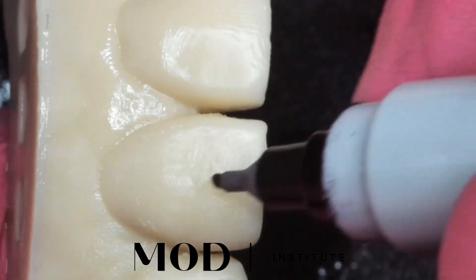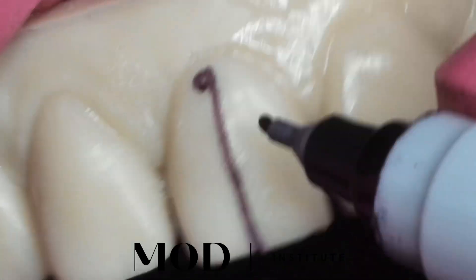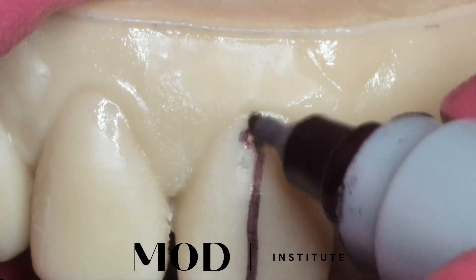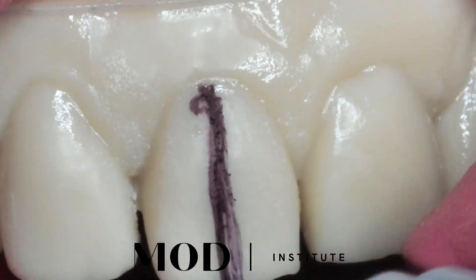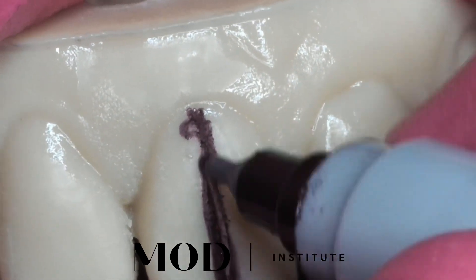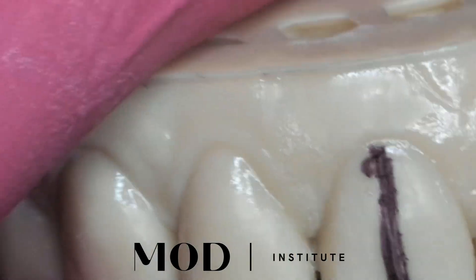Check this out — I'm going to go ahead and mark a little line on the tooth so you guys can actually see how translucent these are when they are at this 200 micron thickness and thinner. They're basically like a contact lens where you have a complete chameleon-like effect where the veneer soaks up the surrounding chromas and actually looks a lot more natural.